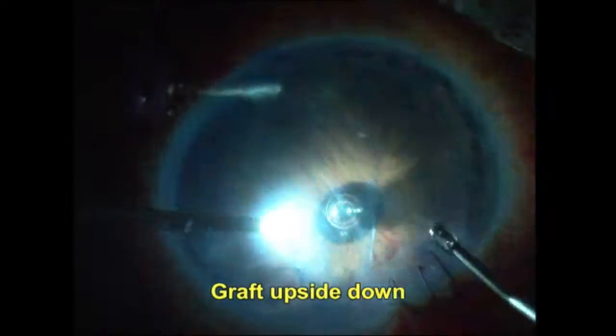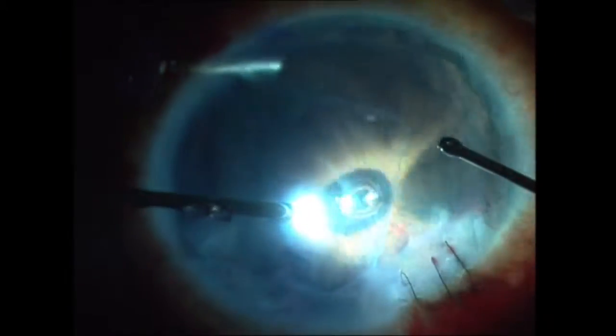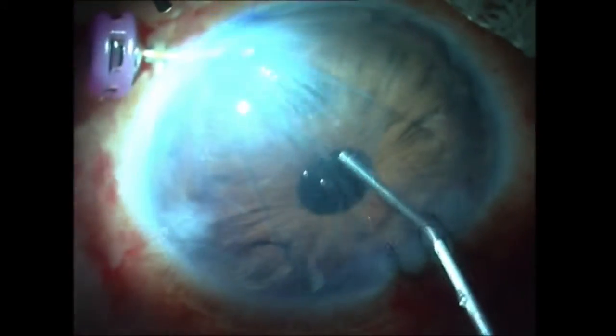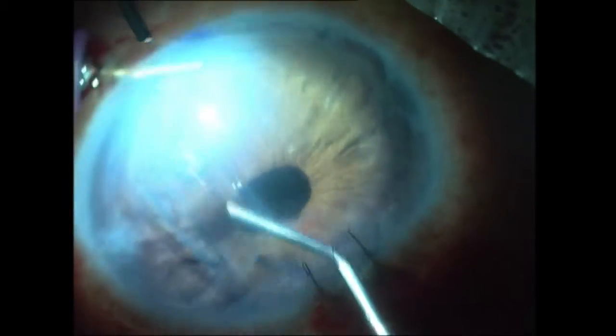Now note at this time that there's no saline, there's no air going into the anterior chamber. It's just plain the BSS that was there in the anterior chamber. For now, you have switched your air pump off. Now you go ahead, you open up the graft and you float it up.